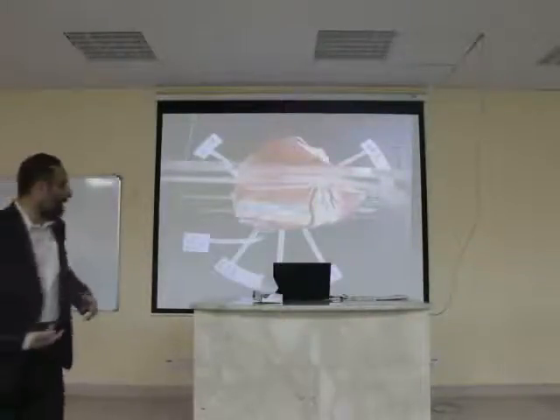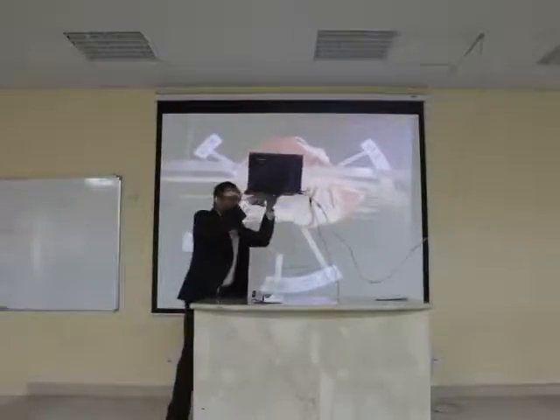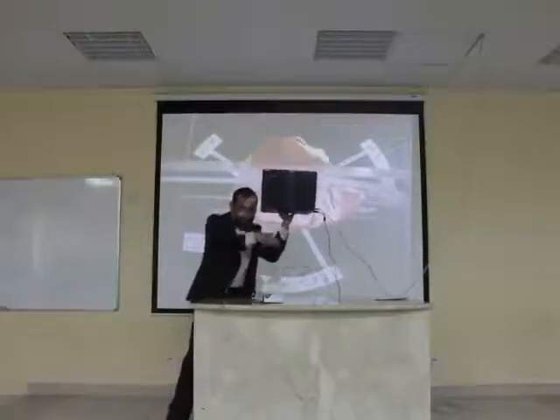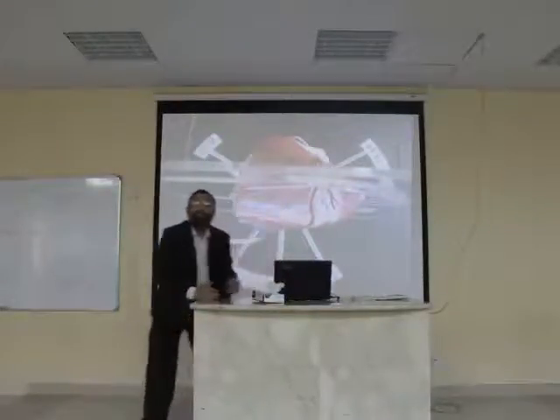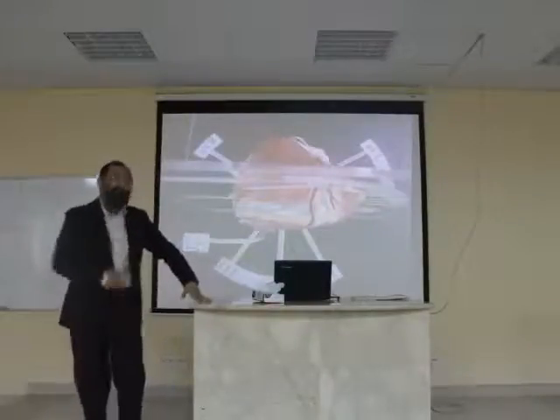They are looking from the inferior surface of the heart like this. So 3 lead systems are recording the inferior surface activity of the heart. If there is any problem, it will show best in these 3 leads, lead 2, lead 3 and AVF, because all are approaching from below.